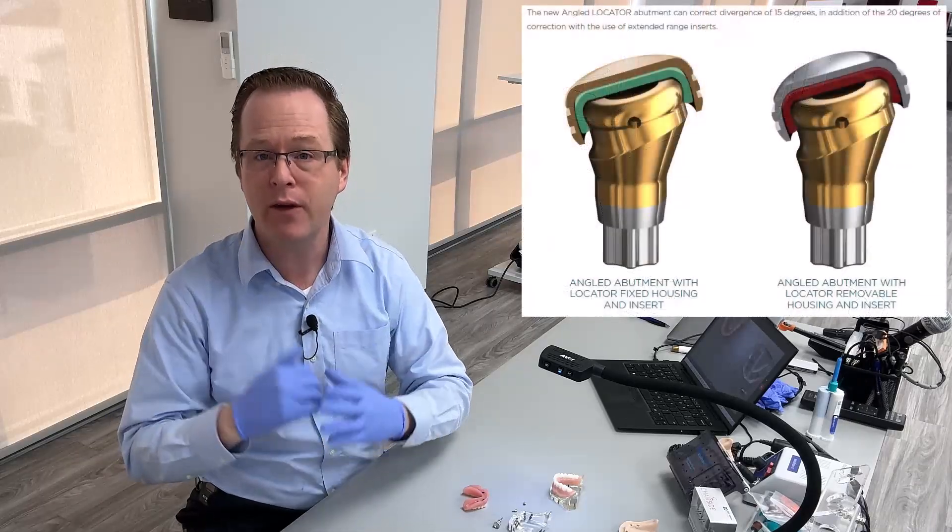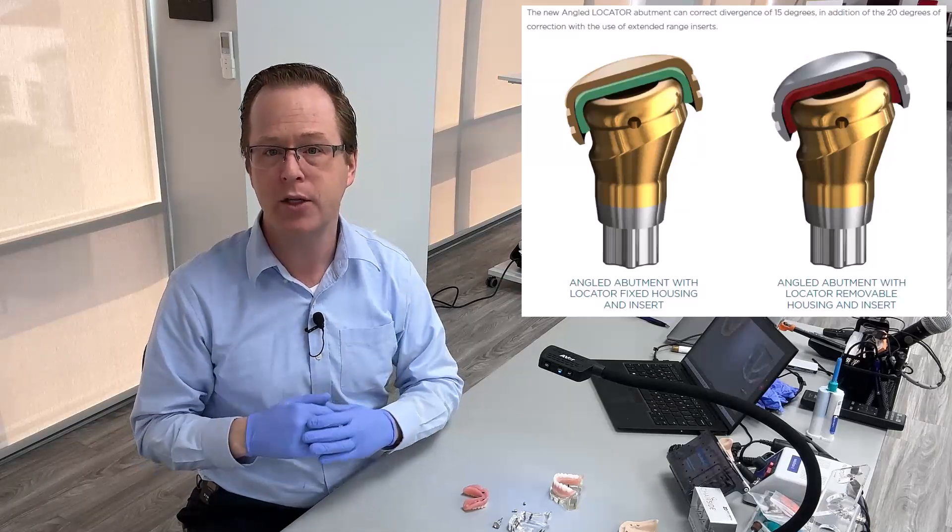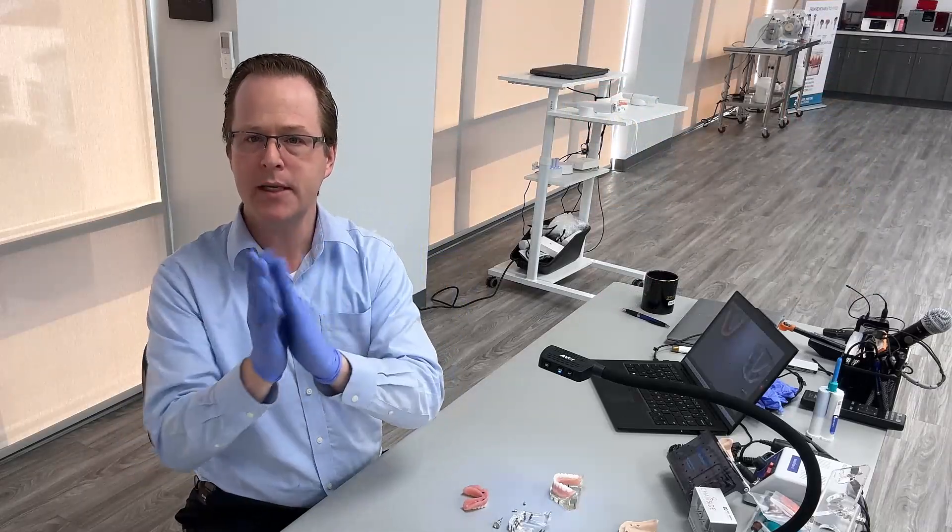But with locator angled, we can tilt those implants for up to 35 degrees of angulation because we get the extra 20 degrees of angulation correction with the extended range inserts, meaning 15 degrees of the abutment plus an additional 20 degrees of the extended range inserts.